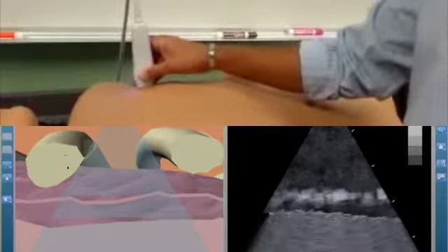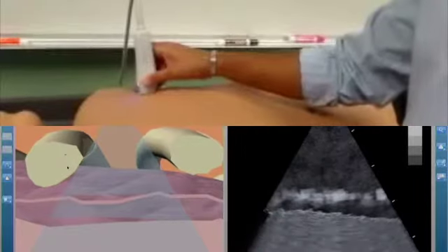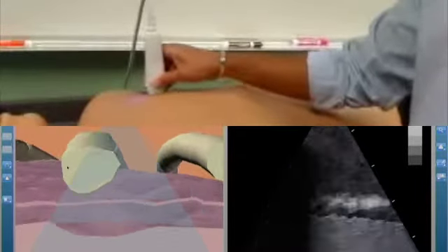We're going to continue that in all 6 areas of the anterior ultrasound examination to evaluate for pneumothorax. And again, as the PowerPoint discussed, we can use M-mode to get a higher fidelity image quality to evaluate for this phenomenon of lung sliding.